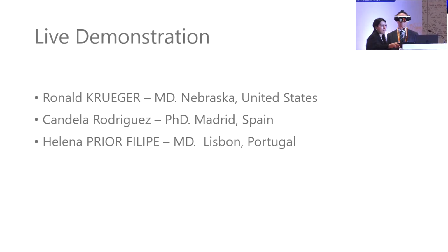It has to be adjusted for the refraction of the person, and then we can try a headset and ask Professor Kruger, what is the experience?